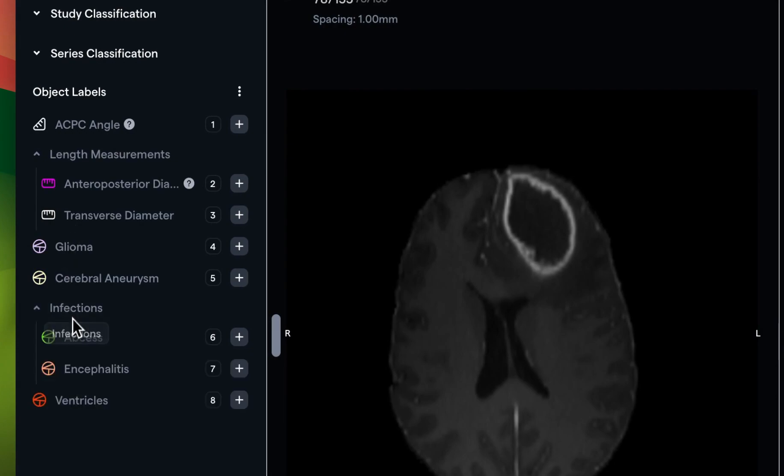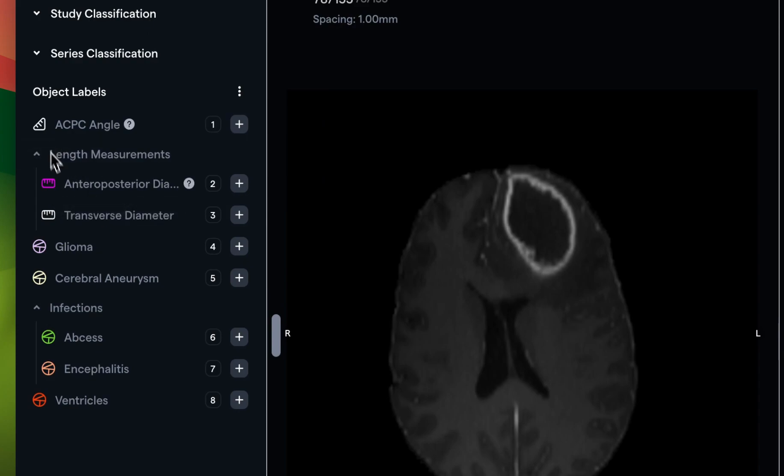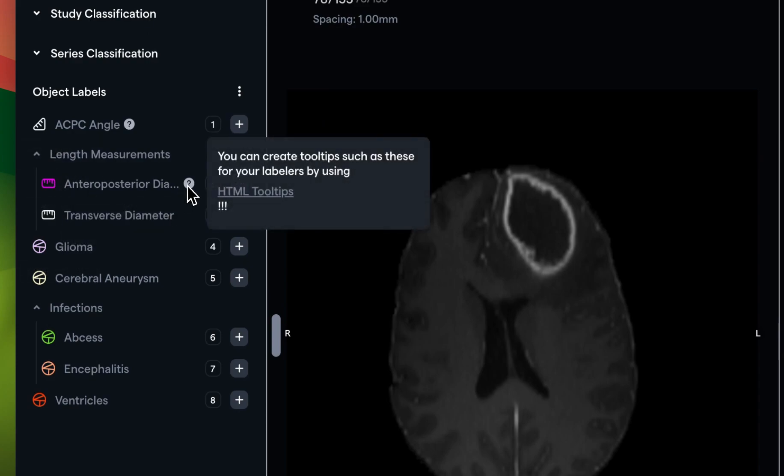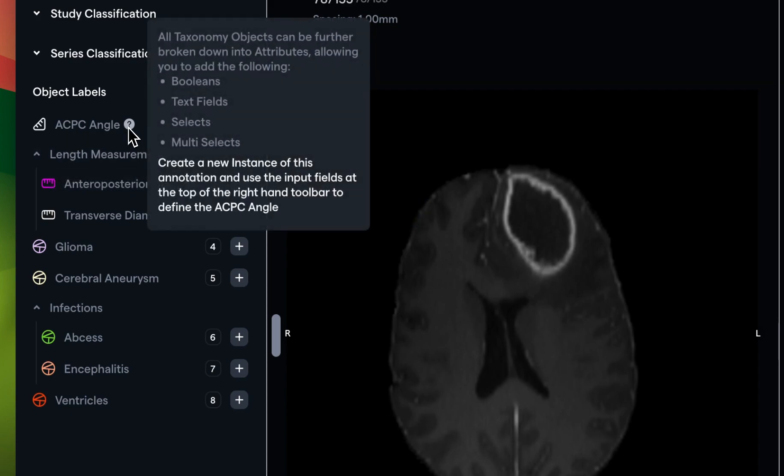You'll see the annotations listed in the left-hand menu here, along with simple descriptions, their type, and HTML tooltips that your admins can optionally leave for you. These could include anything from instructions, links, reference images, but you may not see these in every project.